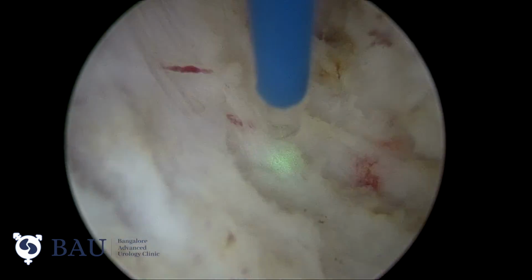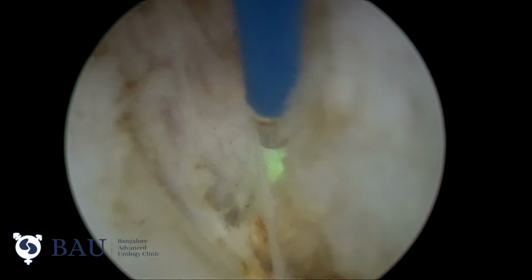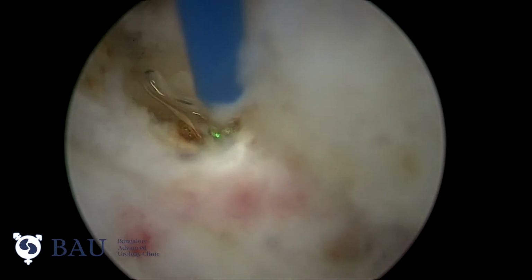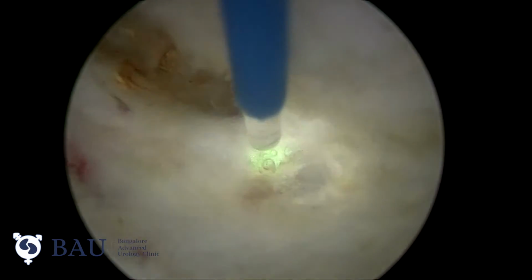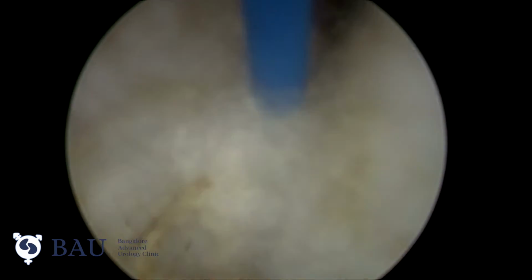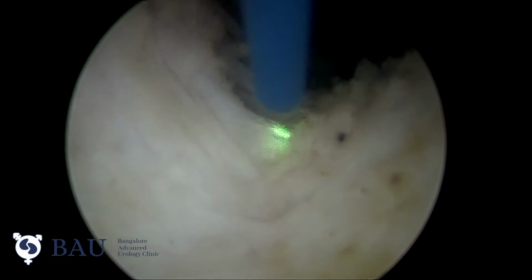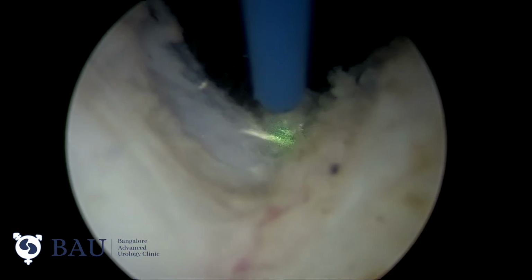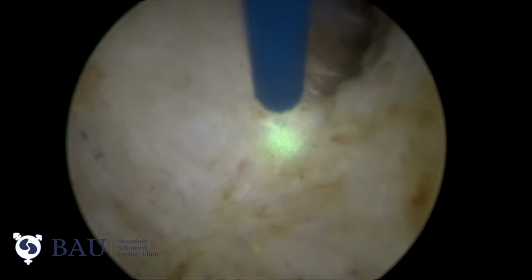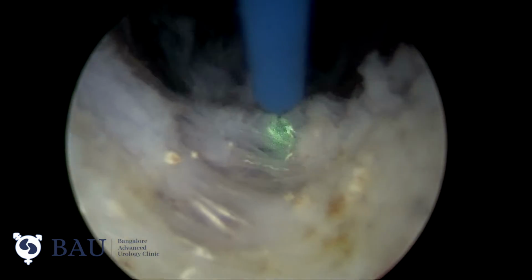Entering the bladder at 11 o'clock gives certain advantages. One is it is a safe zone where there are no important structures like the ureteric orifice or major blood vessels, so we can enter safely. And once we enter there, we can proceed downwards, making sure that we are not injuring any ureteric orifice, and the plane will be clear.